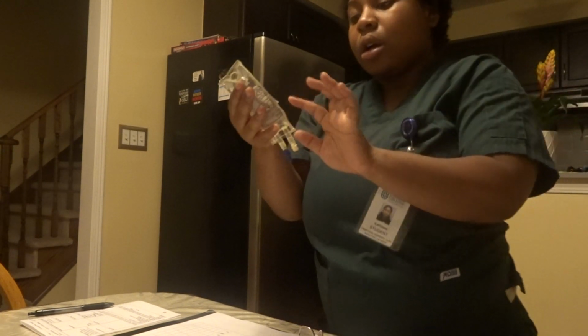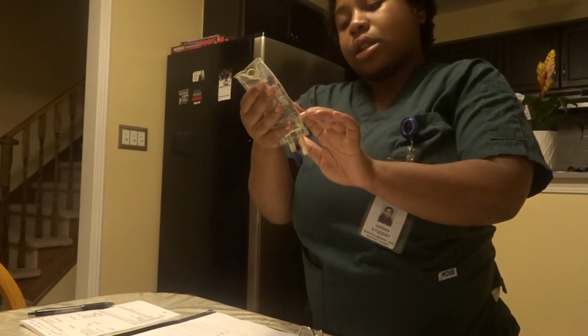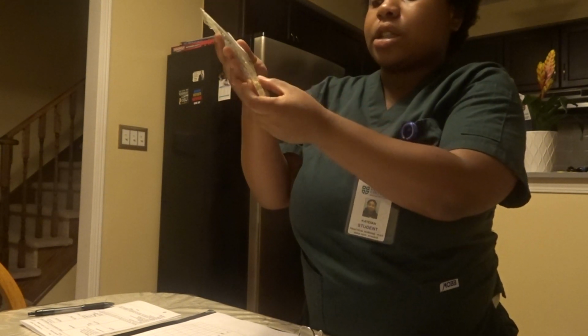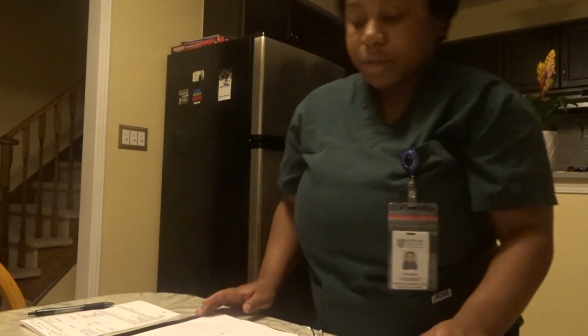And then the expiry date, check the expiry date, it says August 2028, and on the bag itself it says January 21st. So I can see that the bag is okay. So then I go on to do my first check.